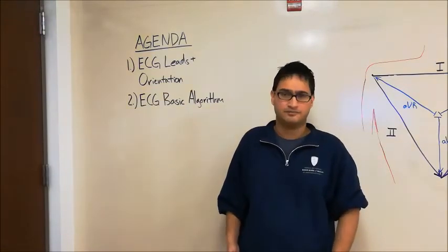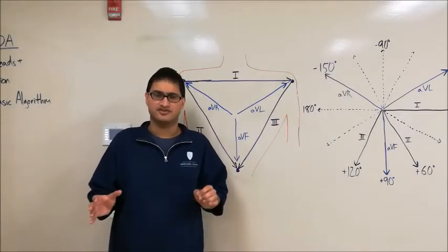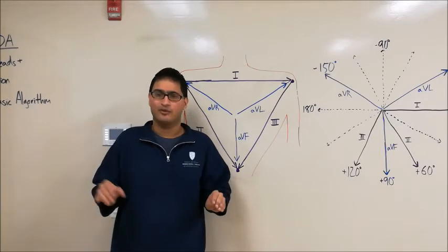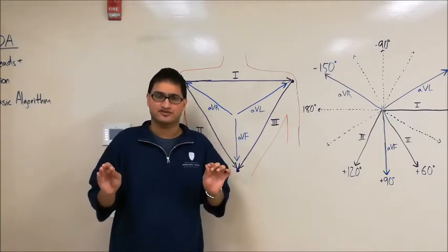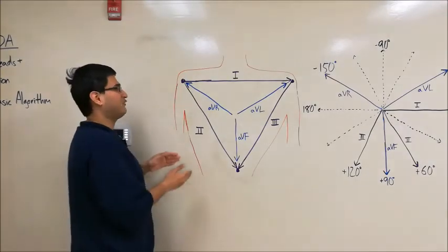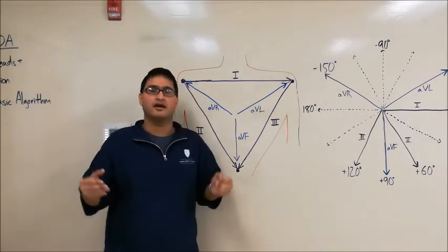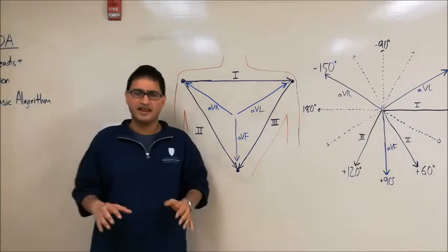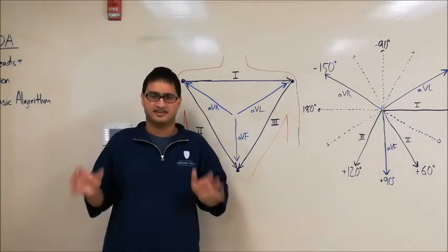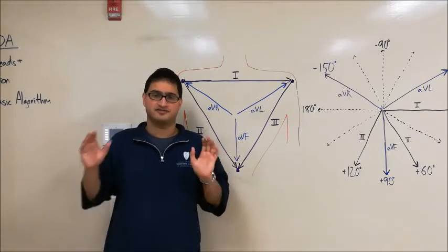So a standard 12-lead EKG is comprised of two groups of 6 leads. We'll be taking a look at this first group of 6 leads that is known as the hexaxial leads. So here we have the outline of a patient with these 6 leads overlaid on them that are represented by blue and purple vectors. Now it's important to know that these 6 leads are actually information obtained from 3 electrodes that are placed on the patient's body.